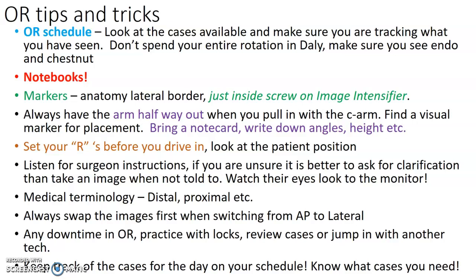Set your R's. So remember, if the patient is supine, if they're prone, if they're flipped, and it's all about that smiley face, and I'll go over that in a second. Listen to the surgeon for instructions. Watch their eyes. I always watch their eyes. If they're not looking at my monitor, I'm not fluoroing. Review your medical terminology. They may tell you to go distal, proximal, superior, inferior. You have to know those.